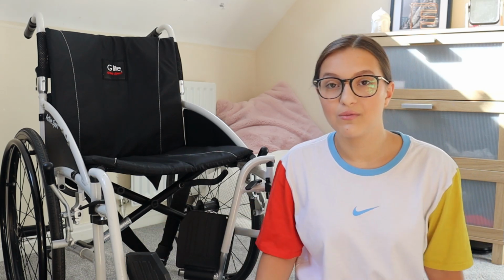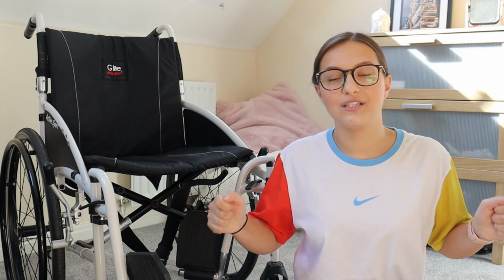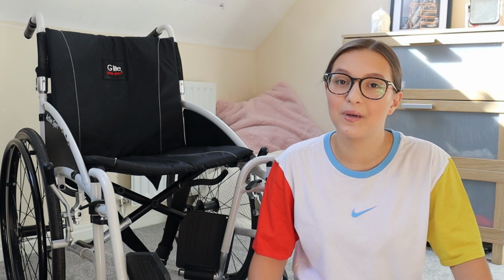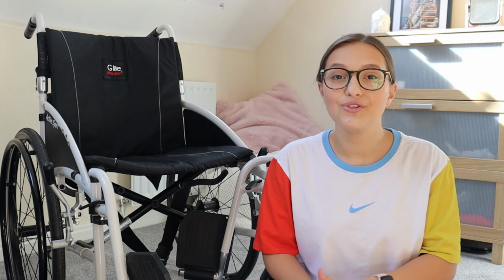This wheelchair originally comes with armrests on it, but I found it easier to push myself without the armrests on it, so we just took them off. I used this wheelchair for 4 years before I upgraded properly to my new wheelchair. I do still, however, use this wheelchair sometimes, as I keep it at my mum's house, so if I'm having a bad day when I'm at my mum's house, I will use this wheelchair and she'll push me around.